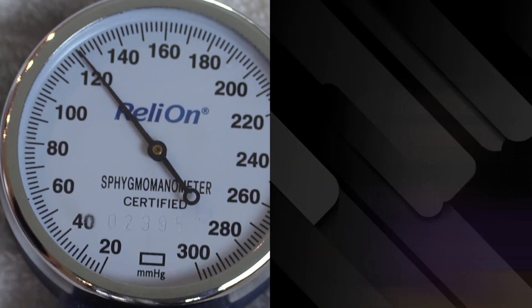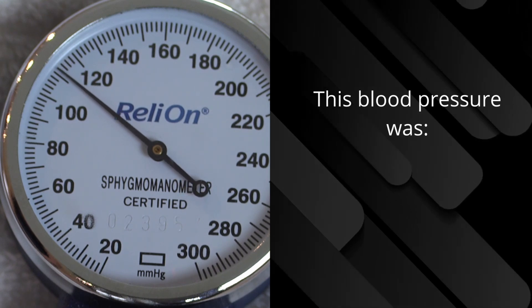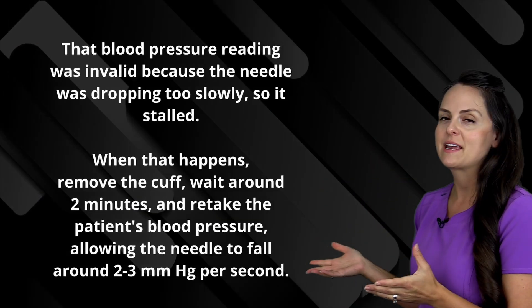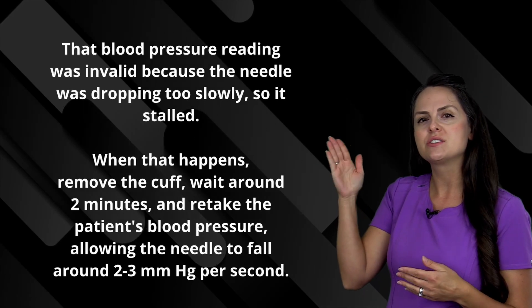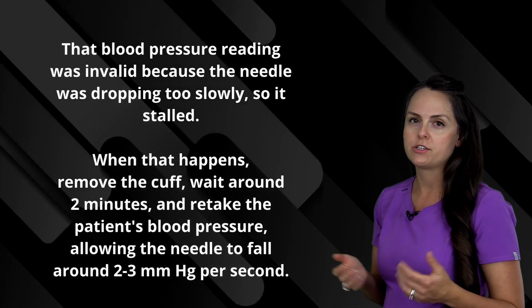Here's another blood pressure. In this blood pressure reading example, the air was not released fast enough. What happened is that the needle sort of just stalled and was just bouncing. Therefore, you would just want to retake this blood pressure in about one to two minutes.